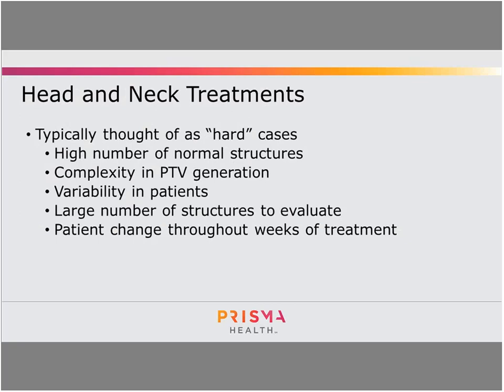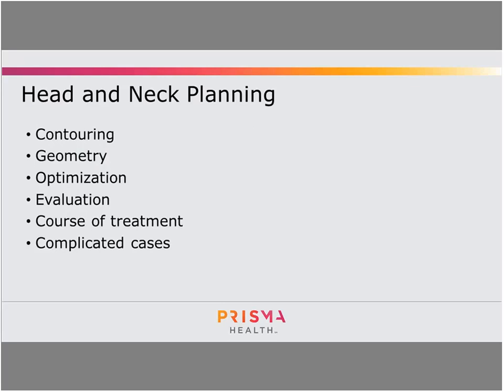When you're optimizing, there's just a lot of different things to keep up with and evaluate. And one of the most frustrating things is that the CT we take of these patients is rarely what the patient looks like all the way through treatment, especially once you get to week 4 and 5. You typically see weight loss and things like that. Those are some of the things that add to why we think of these as complex cases.